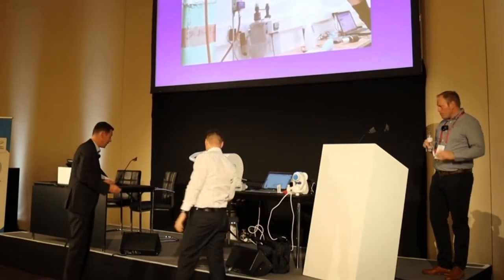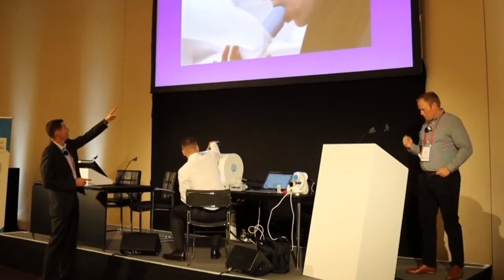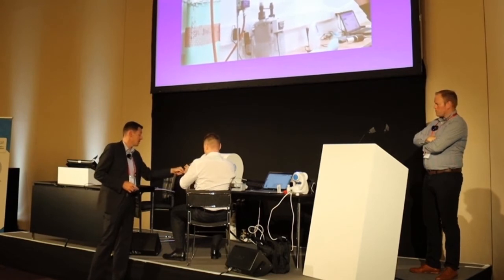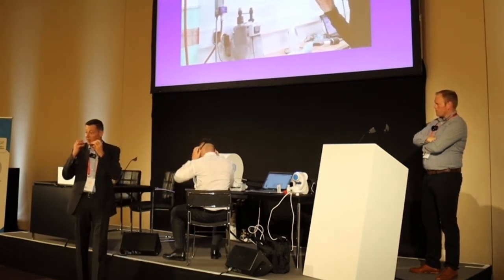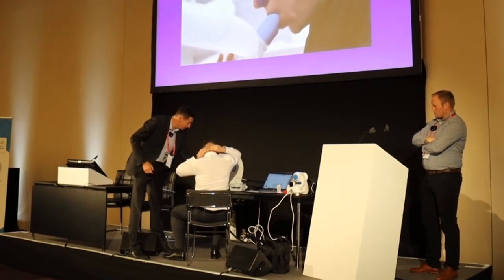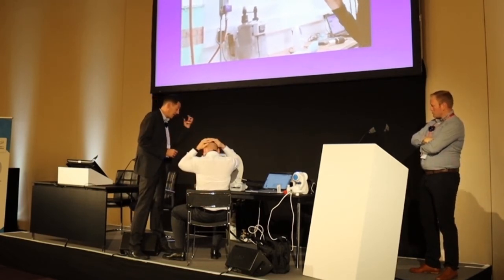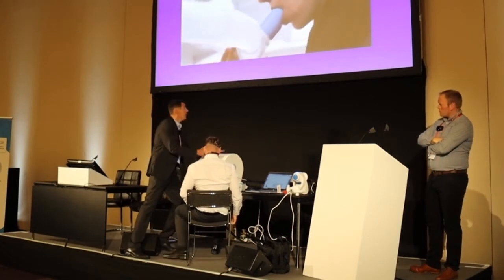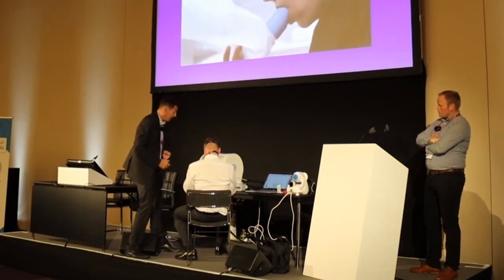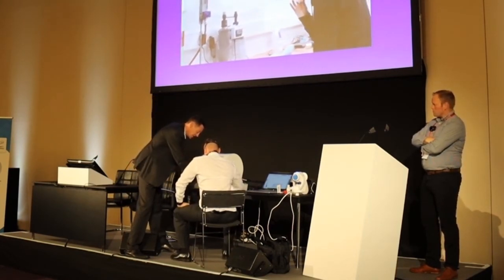So we just prepare Benjamin. The gas bottles are here behind the device. He will take the face mask on. It looks similar to what you see on the screen. The only difference is that we do not use a tube to both sides. We just expire to the ambient air over valves in the mask. The device itself is set up, you can set up the target concentration, and especially the target ventilation. You can hear now it's applying the gas. The reason why it's so big is that this reservoir is included in the device. This reservoir bag is going to be filled up, and then let me start, because it takes 5 to 6 minutes, and then I can continue with a few explanations as well.